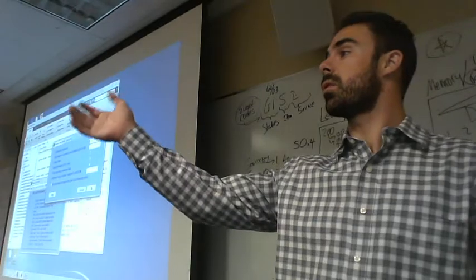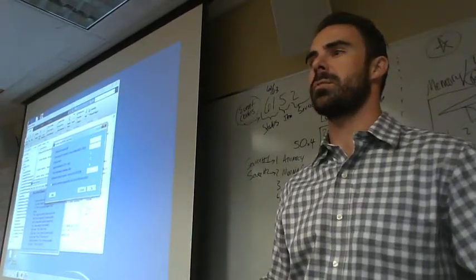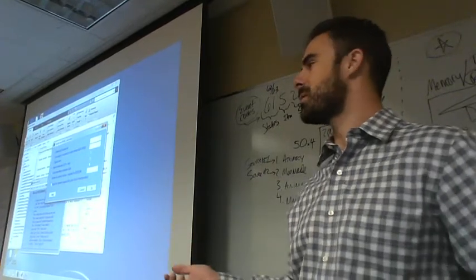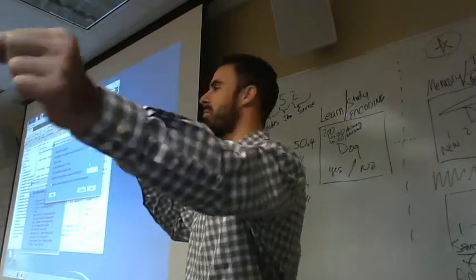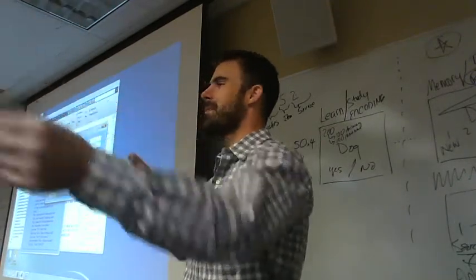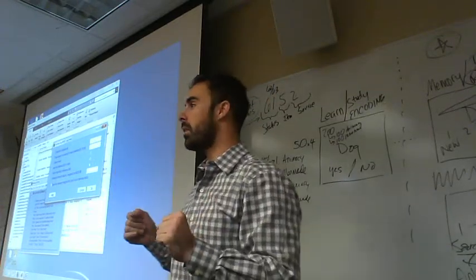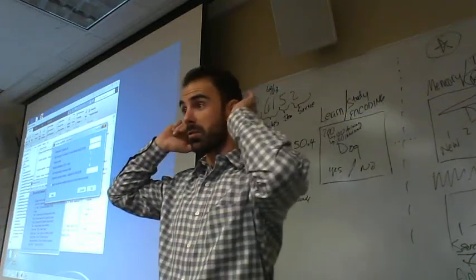Yes, it's our electrical measurements to compare to. So I was teaching a class last night in behavioral neuroscience about action potentials, teaching everybody all the good stuff of our EPSPs and IPSPs. When you record from a neuron, there's always a reference electrode out in the extracellular bath, right? Same idea when we record from the scalp, we have an electrode somewhere else to compare to. And you're right, our numbers were 33 and 34, and they represent our numbers for the mastoids.